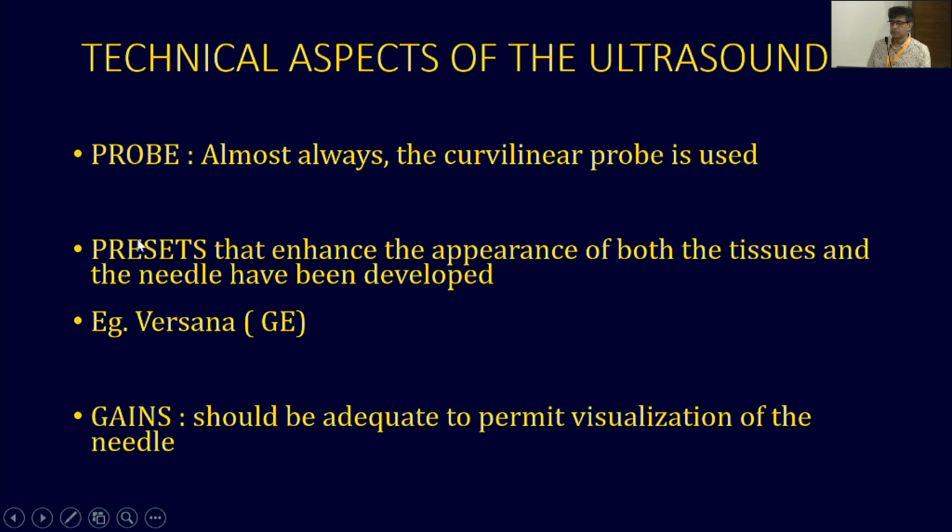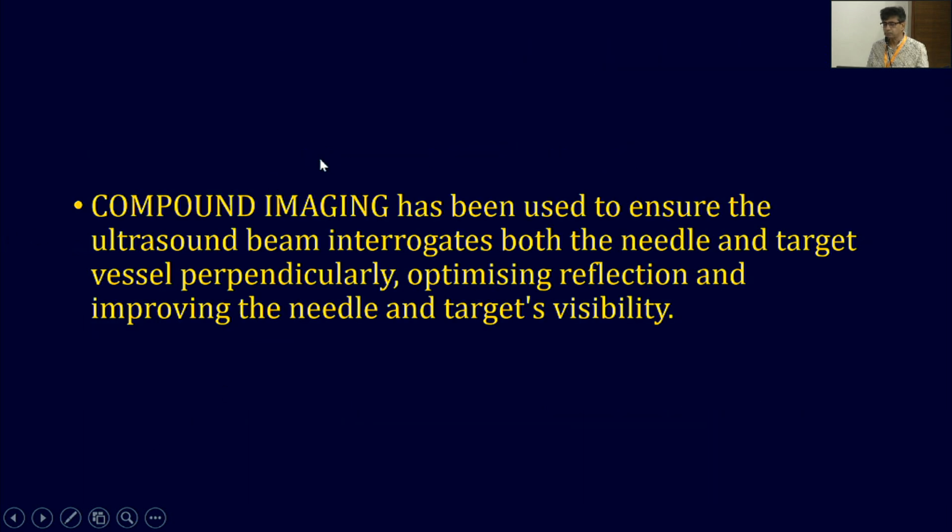But recent machines have special presets which are useful for interventional procedures. Gains should be high to adequately permit visualization of the needle. There is a button called compound imaging.